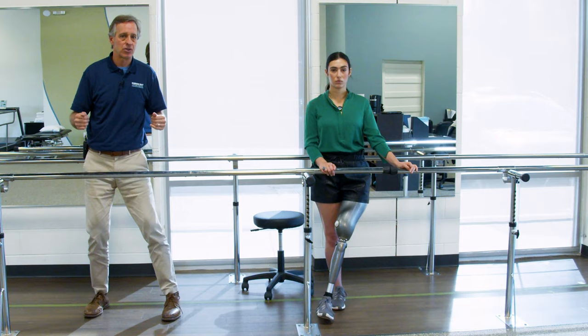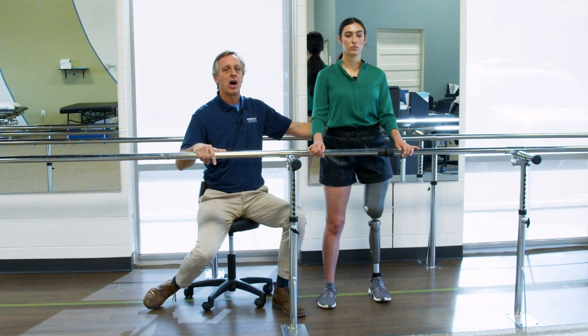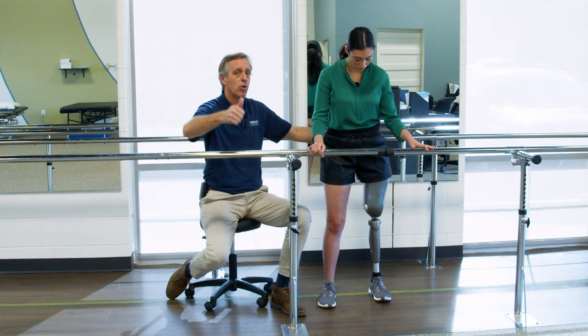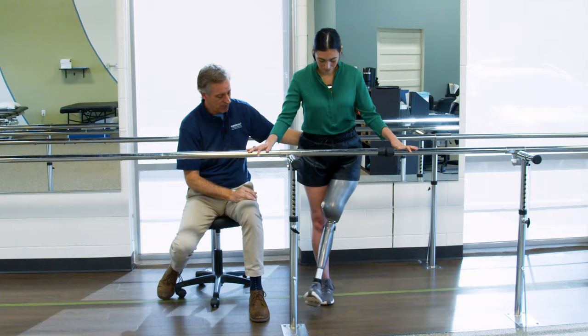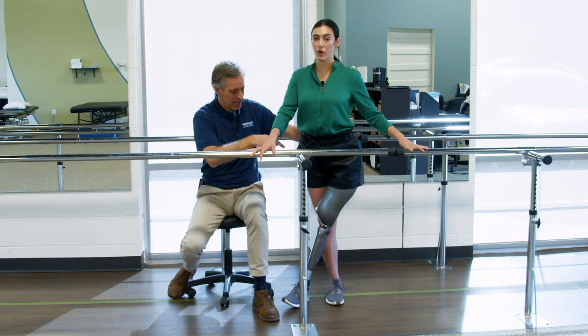The second reason why this is so important is it teaches you how to load the prosthetic in an awkward position. Remember, prosthetic devices in general, the heavier you load on them, the more they want to stand up straight. So you want it to stand you up straight. If you step on it lightly, it could buckle or release underneath you. So you always want to think, go ahead and step across, Tracy. Even if that's in kind of an awkward, weird position, not really landing smooth on the ground, doesn't matter. Put as much weight on it as you can, and you'll find out it straightens right up.